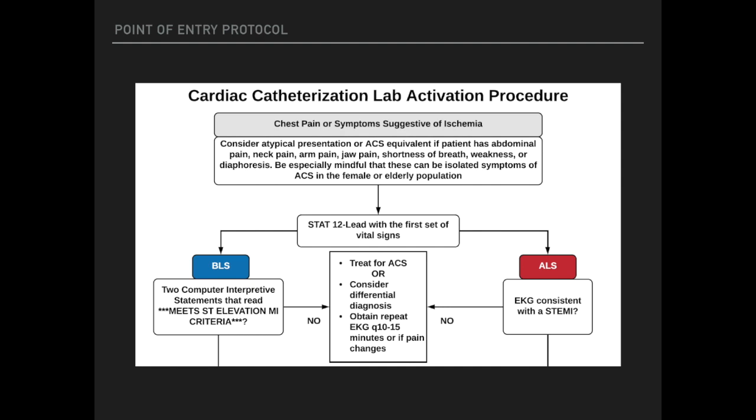Now, if you're a BLS provider, once that 12 lead prints out, you look for the statement that it meets ST elevation MI criteria. If not, then you continue assessing the patient, repeat the 12 lead, and consider other differentials.